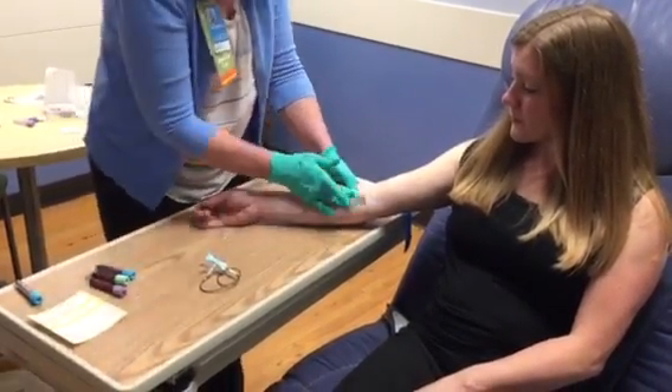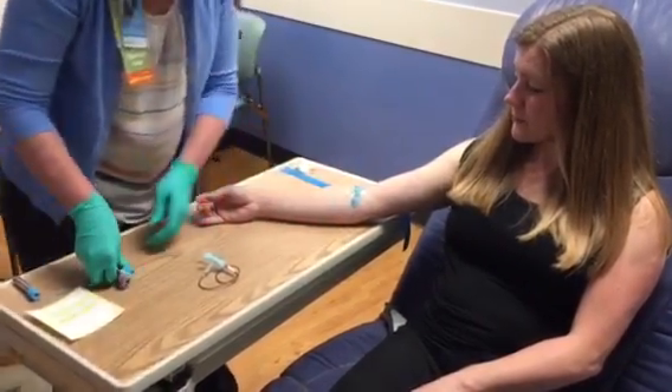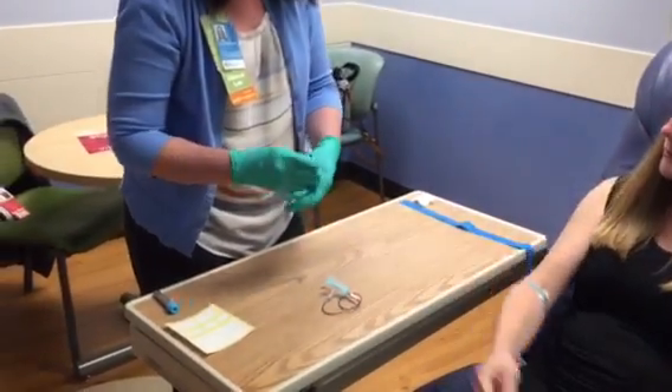Apply firm pressure, get your band-aid, and complete your inversions eight to ten times.